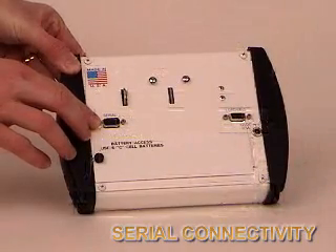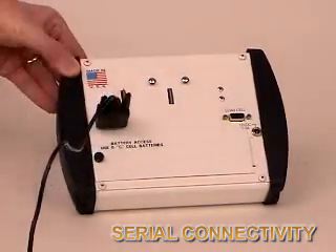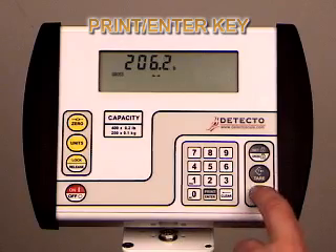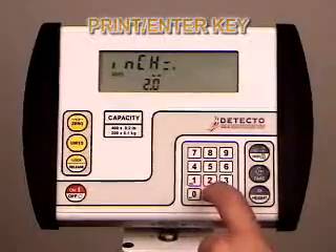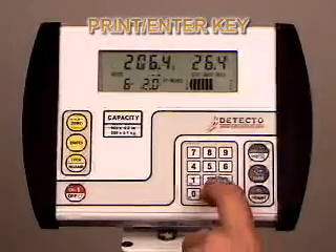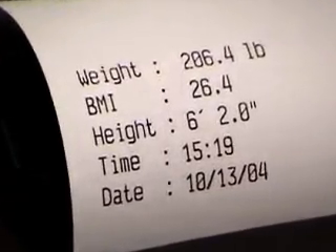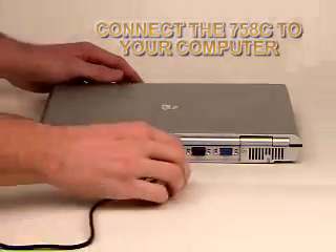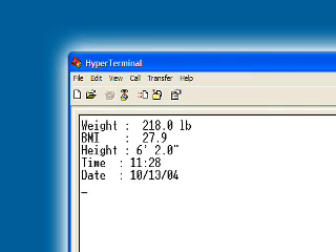One of the primary new features of the 758C is serial connectivity, which provides output to a printer or computer for recording weight, BMI, height, time, and date. Data sent to a PC is very useful in electronic medical record keeping. Printing weight data is easy with the new 758C. Once a printer is connected to the 758C's serial port, it's just a matter of pressing the print enter key. In this case, a 6'2 patient weighing 206.4 pounds is having their BMI calculated. With a simple push of the print enter key, the data is output to a printer giving you a paper copy of weight, BMI, height, time, and date. Connect the 758C to a computer by using the serial port and you now have efficient electronic medical record keeping, useful in physician's offices, weight loss clinics, or athletics. By pushing the print enter key, the weight data is sent to the PC and can be automatically inserted into a patient's medical records with the push of a button, giving you the option of having weight, BMI, height, time, and date inserted electronically into your medical records simply by pushing one key.